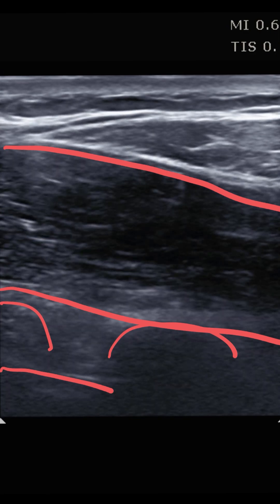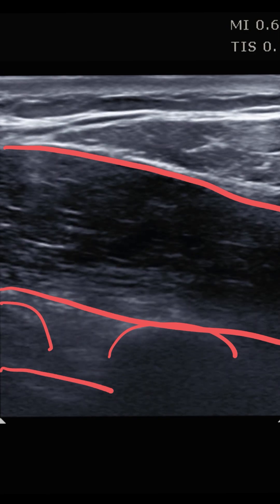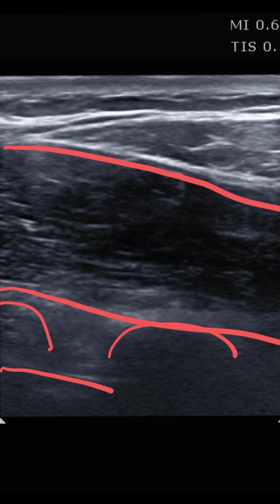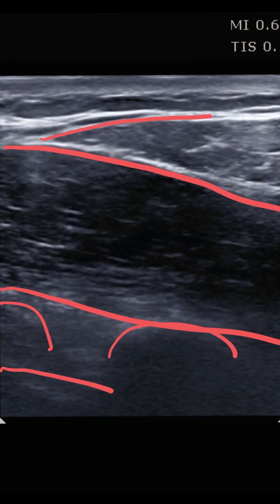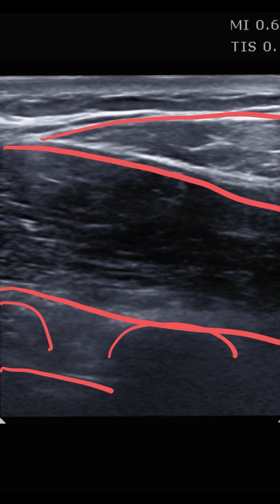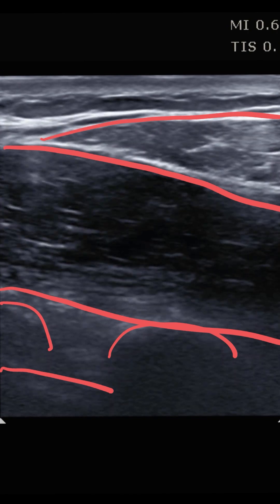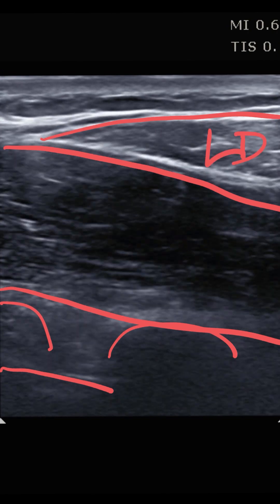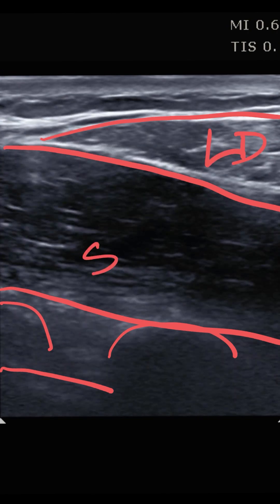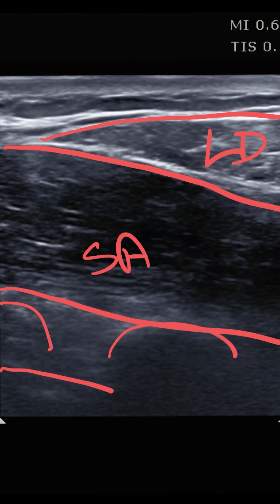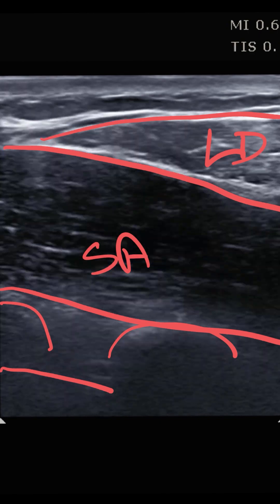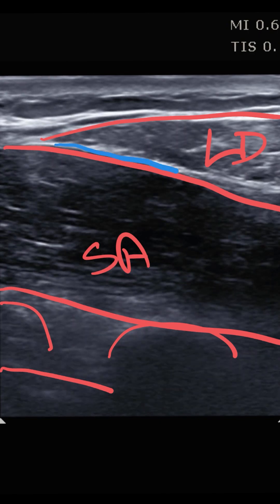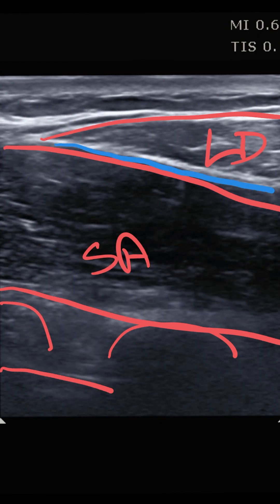The latissimus dorsi, in this axillary region in the coronal plane, is going to be this wedge-shaped muscle as it kind of terminates out in the lateral part of the chest wall. So we have the latissimus dorsi and the serratus anterior. What we're looking for is a deposition of anesthetic material in this plane right here.